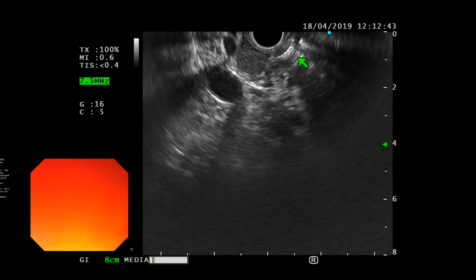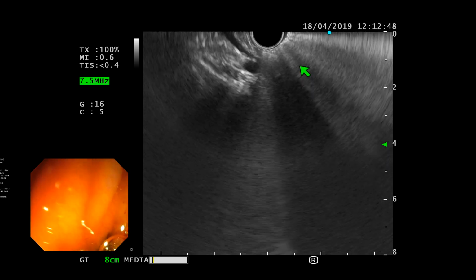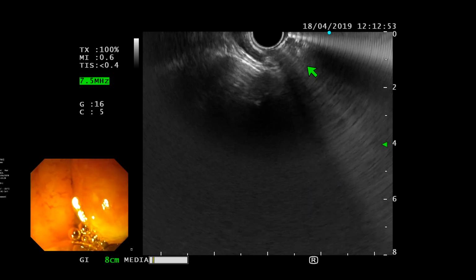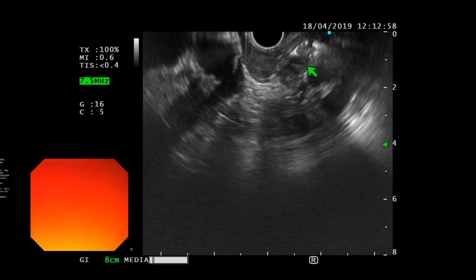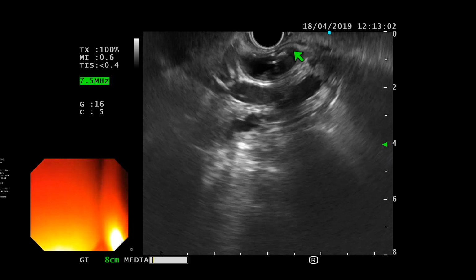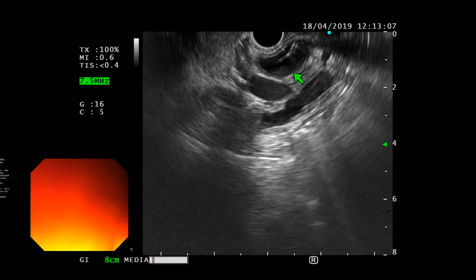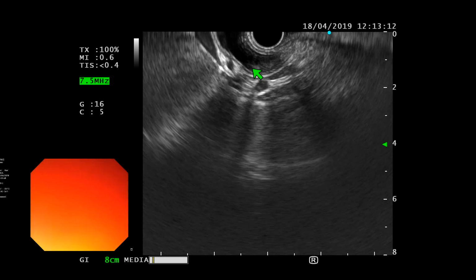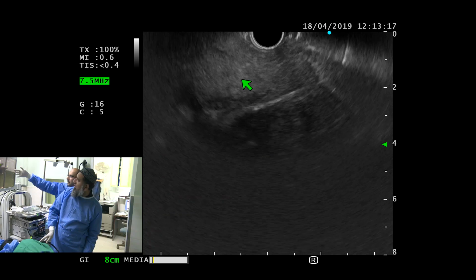If you relax your big wheel a tiny bit, there, that's your stent right there. And now you're falling down, so you have to keep the big wheel pushed up against your wall and go counterclockwise again. There's the stent. You see the walls of the stent. Now keep going counterclockwise towards the liver, because you have to be able to look up into the liver. Relax your big wheel. Keep going.